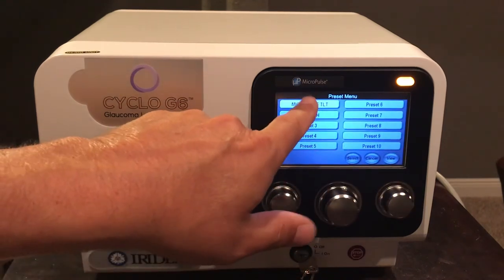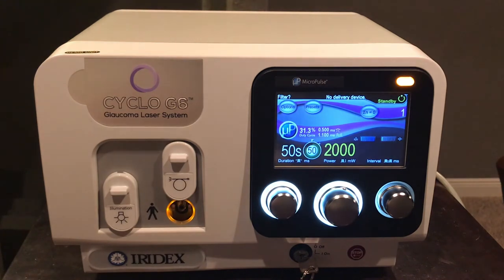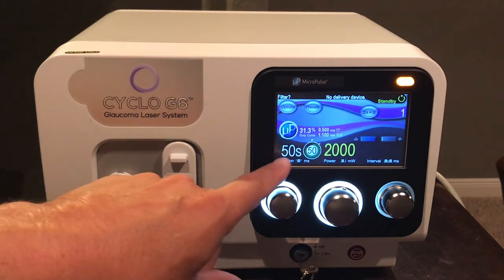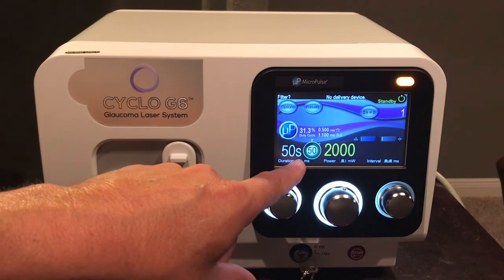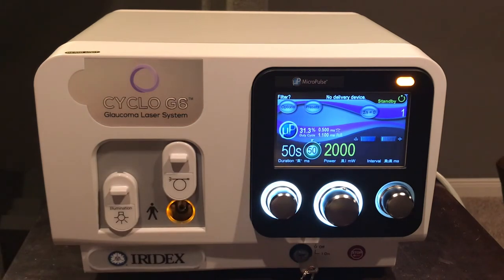For micropulse mode, go back to the preset, select micropulse TLT. You will see 50 seconds duration, 2000 milliwatts, and the duty cycle lit up at 31.3 percent — cycling on for 0.5 milliseconds then off for 1.1 milliseconds throughout the entire procedure. This heats the tissue and then allows thermal relaxation during the 1.1 millisecond off period before cycling on again.